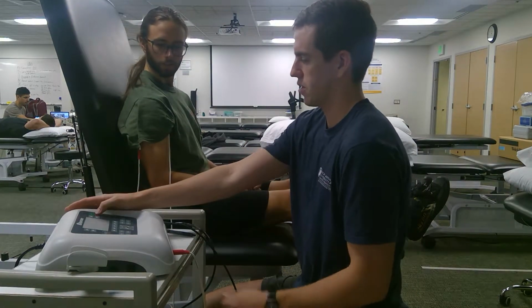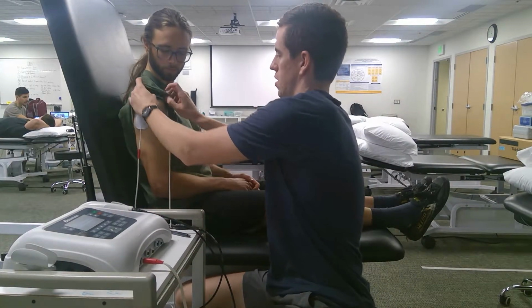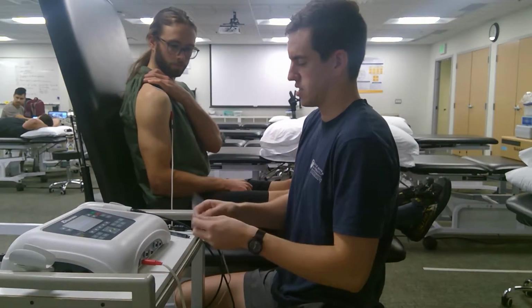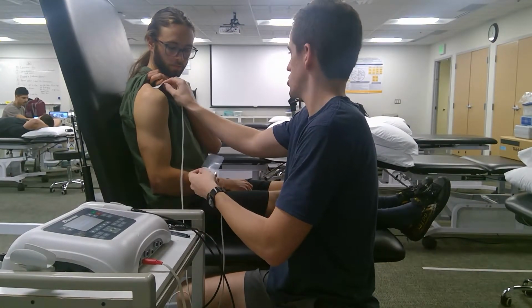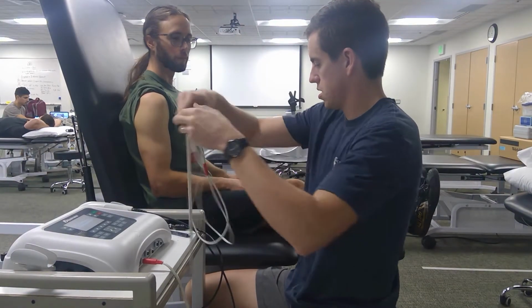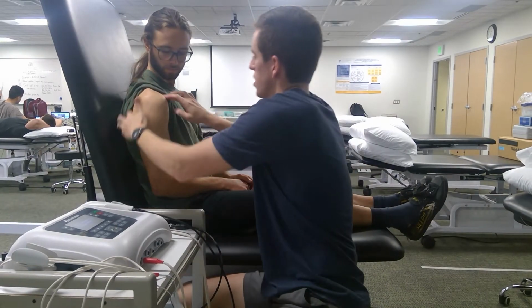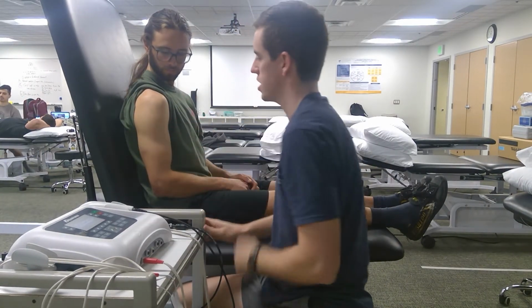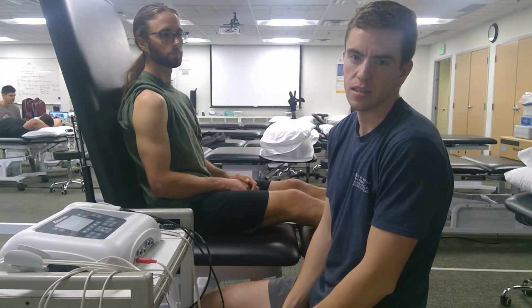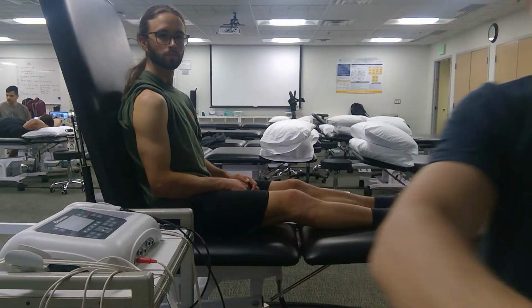Alrighty, and then we're going to go ahead and stop, and then we'll remove the treatment, and then we'll assess the patient's skin and ask them how the treatment went. Did that stay comfortable throughout? Did we need to change anything there? Yeah, no, it felt good. Okay, and then I'm just going to go ahead and assess the skin, make sure we didn't cause any burning or irritation. And that was how I would apply the high frequency TENS using biphasic pulsed current.